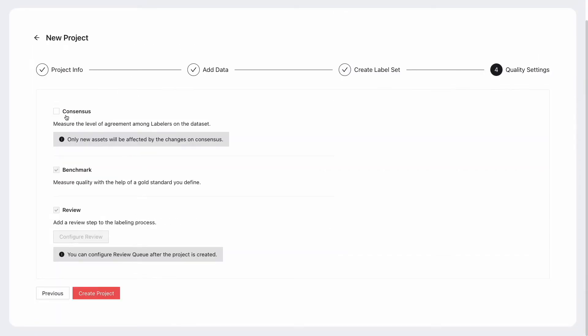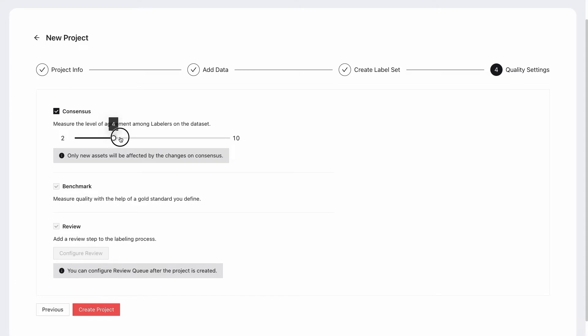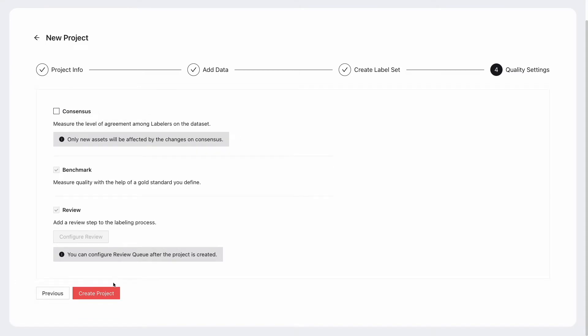Lastly, if you'd like for the same data to be annotated by more than one labeler, you can change that setting right here. In my case, I'll leave it off.